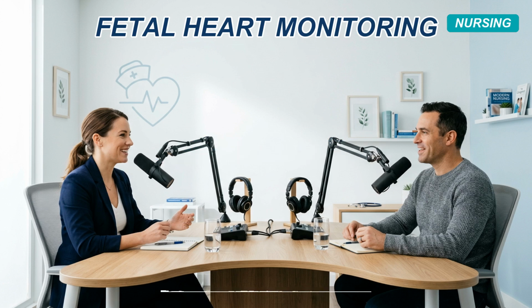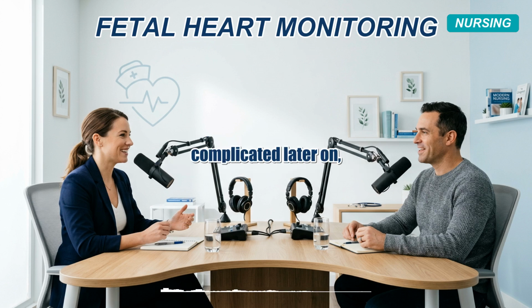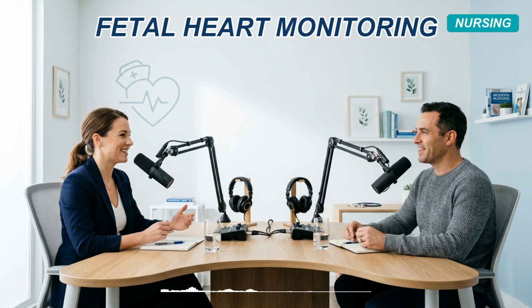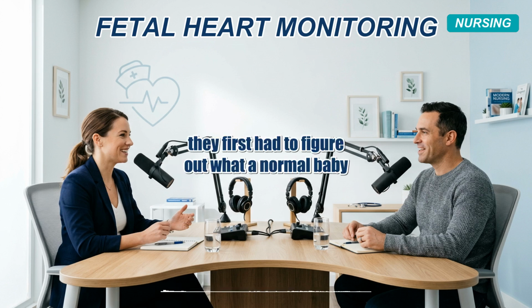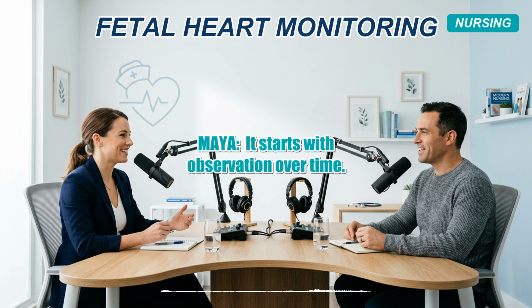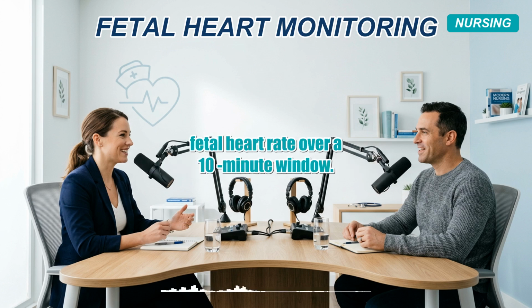That is stunning. But to understand why the evidence ended up being so complicated later on, we really need to dive into the physiological mechanics. Let's do it. So hospitals rolled these machines out everywhere. For the machine to actually warn doctors of danger, they first had to figure out what a normal baby looked like on paper. How do you even establish a baseline? It starts with observation over time. A clinician looks at the tracing and establishes the baseline fetal heart rate over a 10-minute window.